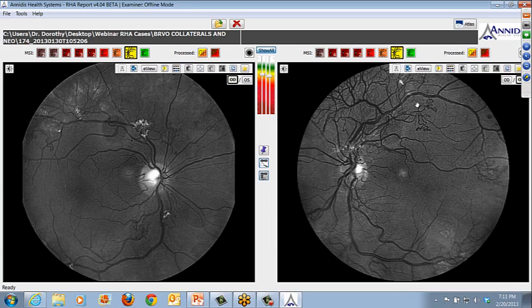You can see some small petechial hemorrhages along the edges of the small retinal capillaries here that are persistent. You'll see that often in old vein occlusion. And you know that this was older because of the collaterals here that have all formed in this hemifield of the retina. There are some other areas down in here that are a little bit harder to see, and this you could validate with your ophthalmoscopy, but mostly look like collaterals. So this is more likely a central retinal vein occlusion because it's involving, of course, both hemispheres.